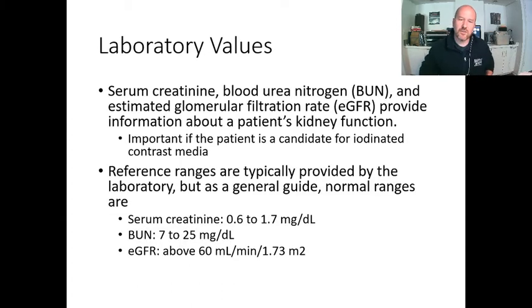Lab values are important to us, and you want to be good friends with your lab department. I am the weirdo who will buy Christmas presents for my lab tech because I want those lab results quickly, because sometimes labs are the one thing holding me up from getting my exam done. So the main things that I am interested in are serum creatinine.